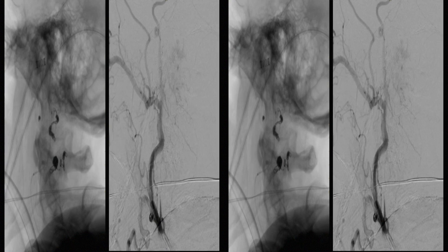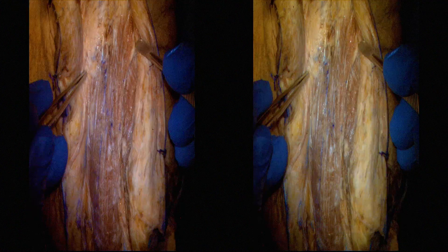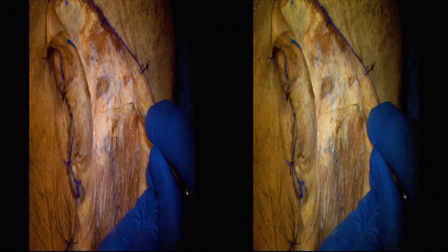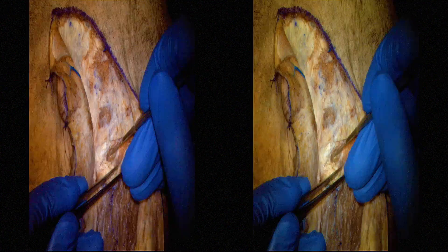Preoperatively, the patient underwent embolization the day prior to surgery. The patient was placed in a supine position with an ipsilateral shoulder roll and the head turned away from the surgeon. The posterior area is exposed through a large C-shaped incision. The cadaver dissection begins with sharp dissection of the sternocleidomastoid muscle from the mastoid tip, and the sternocleidomastoid muscle is carefully mobilized posteriorly.